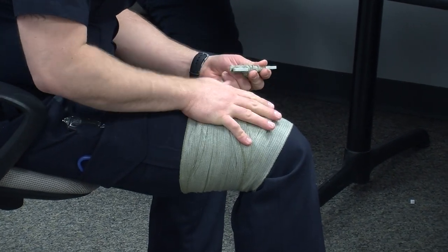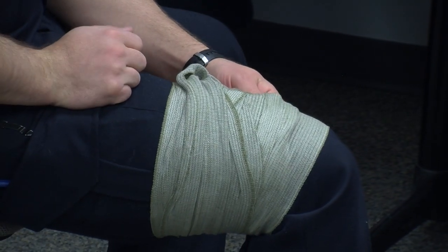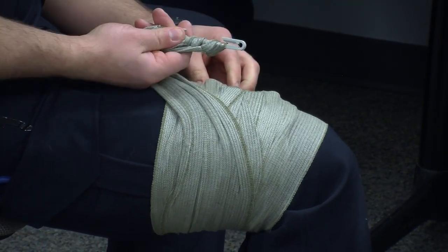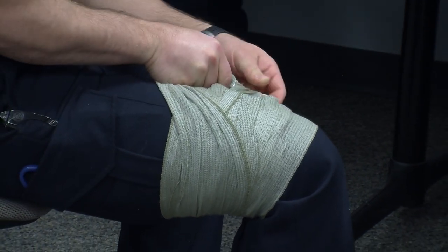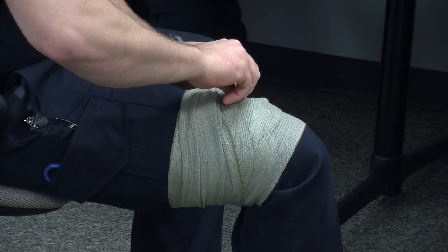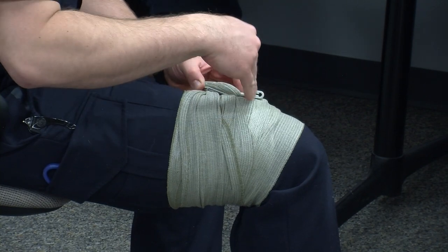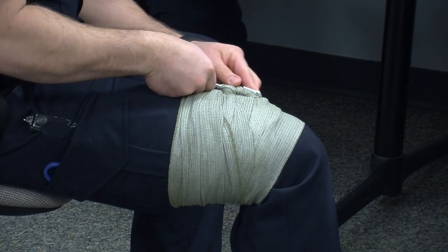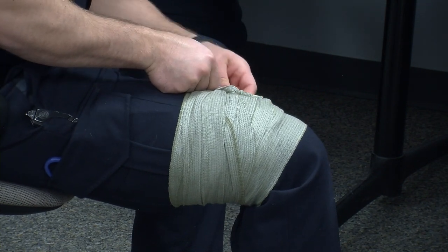When you get to the end, if this controlled the bleeding, great. Clip it on some of the open areas, you're done. If you want even more pressure, find the last few loops that you went through, stick this up underneath and start twisting it just like a tourniquet. It won't achieve the same pressure that a tourniquet can, but if I just need a little bit more pressure to keep the bleeding stopped, I can do that, twist it, and when I'm done, I can hook it back up.